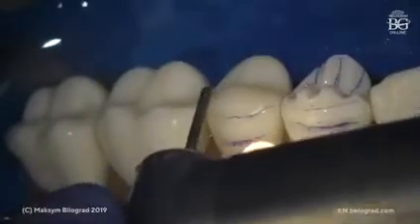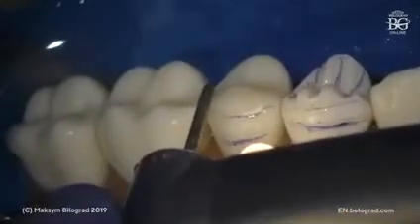Also notice the angle that I'm using now when preparing the occlusal tip of the cusp. I have a slight buccal angulation. Don't do this angle. We do this angle, okay?